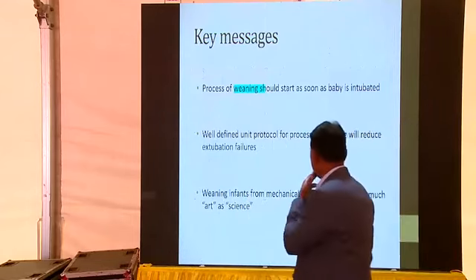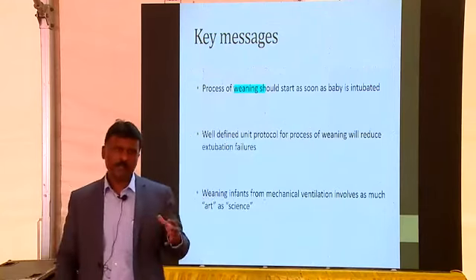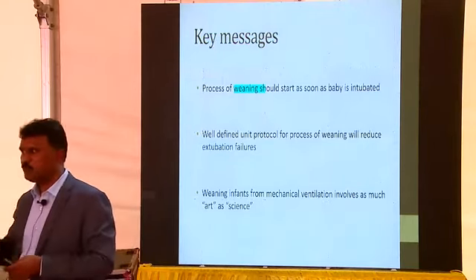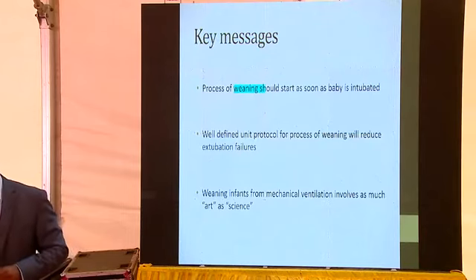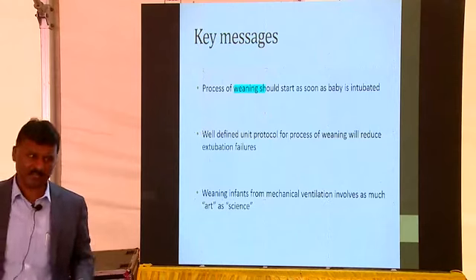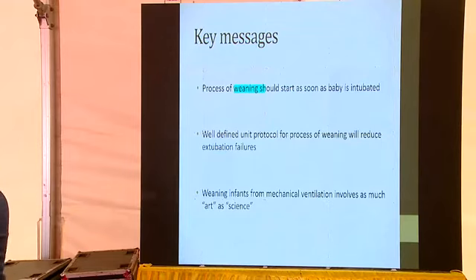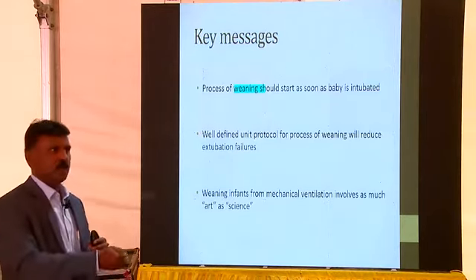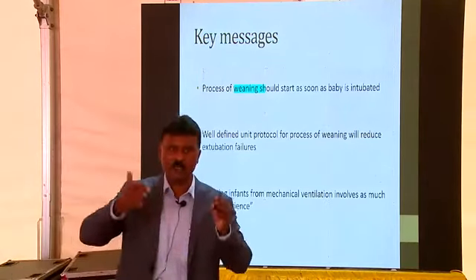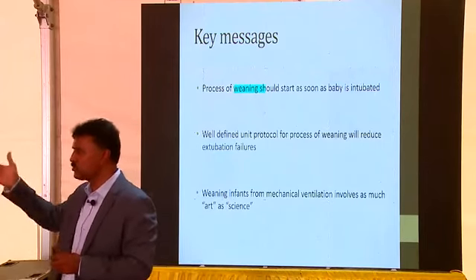Have a well defined unit protocol. I give you the guidelines and explain the pros and cons so that you can go back and decide what to do. You want a clear-cut protocol. Do you want to do a spontaneous breathing trial? Yes, you want them documented. Do you want a pre-extubation blood gas? Do you want an X-ray? You decide how it is to be done. Put it in writing. Train all your nurses and postgraduates.